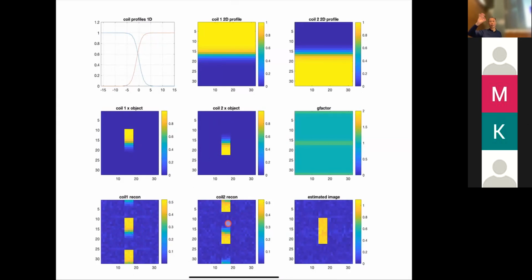I can just solve the equation very quickly, right? I can just do the full inverse, all right? So that's what's in the code. And if you do that, this is the image you get, which looks pretty good, right? It's basically undone the aliasing. It's added these up correctly, and you get a pretty good image. Okay, and it's a noisy image because you've added noise, so that makes sense. This is the best you can do, actually. Yeah, this is the least squares estimate given these two coils.